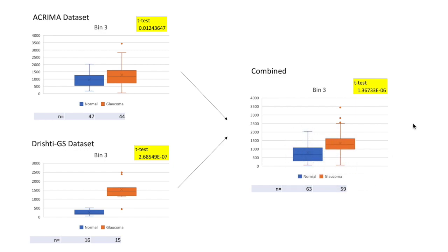But as a computational biologist who studies image analysis and has examined hundreds of these glaucoma images, I'm confident that there are many features in addition to this one that will stratify normal versus glaucoma and stages of glaucoma for refined machine learning predictions based on morphology.